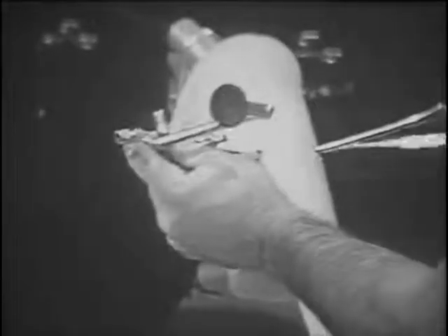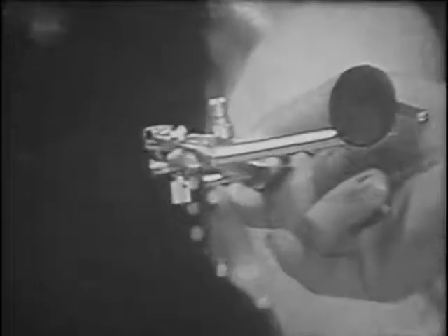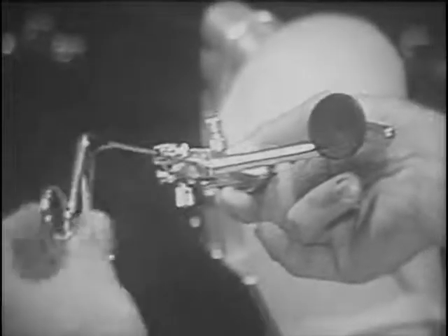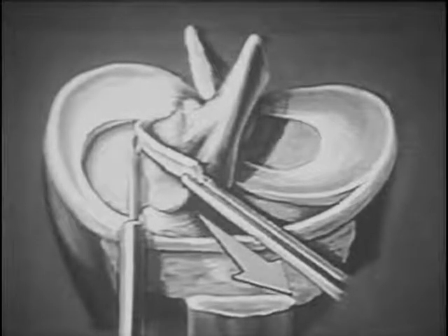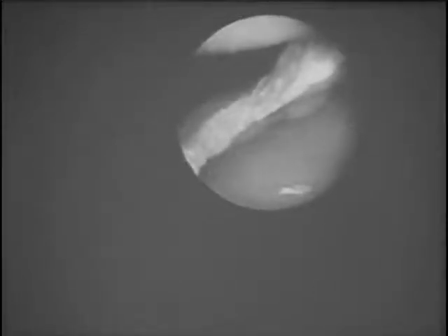The Wolf operating arthroscope is utilized in the medial joint, while the lateral joint has the Johnson jaws grasping the meniscus. A three millimeter hook scissors is inserted through the channel of the operating arthroscope. The scissors then detaches the posterior horn of the bucket handle fragment. Constant tension needs to be kept on the Johnson jaws retracting the meniscal fragment.